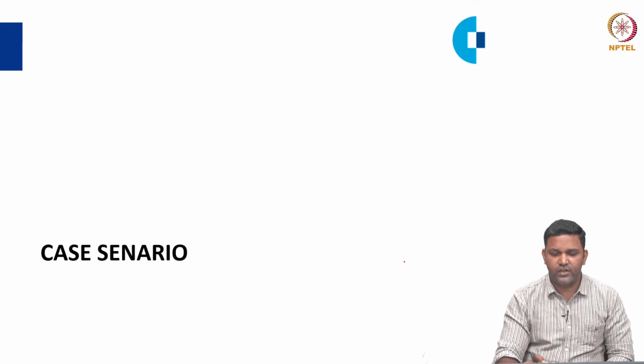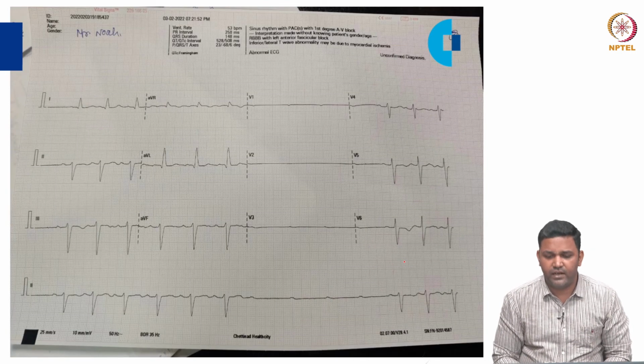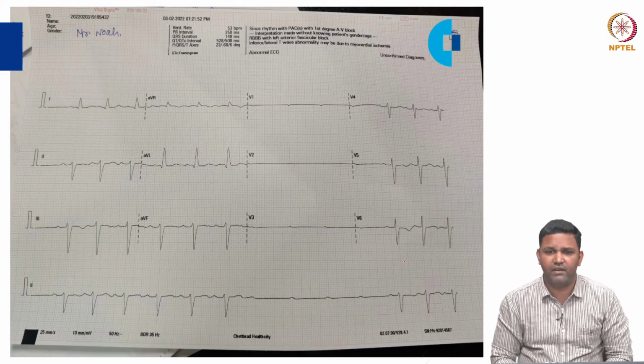So, I will tell you about a small case scenario. This patient had a history of cardiac surgery in the form of aortic valve replacement like 10 years ago. He came to us with complaints of giddiness. The initial clinical examination was absolutely normal and the valve was functioning well in echo. So, we did an ECG.